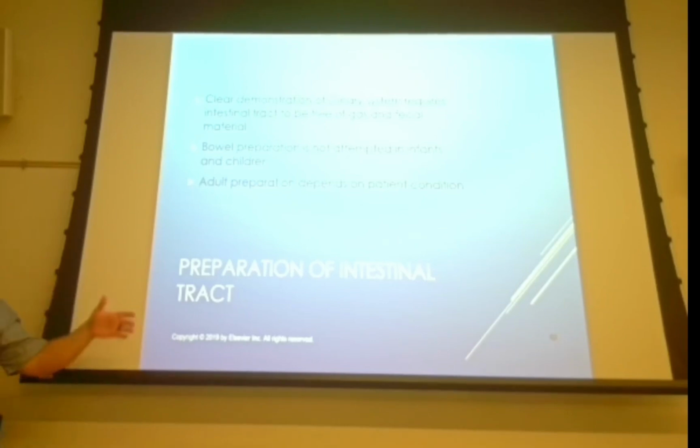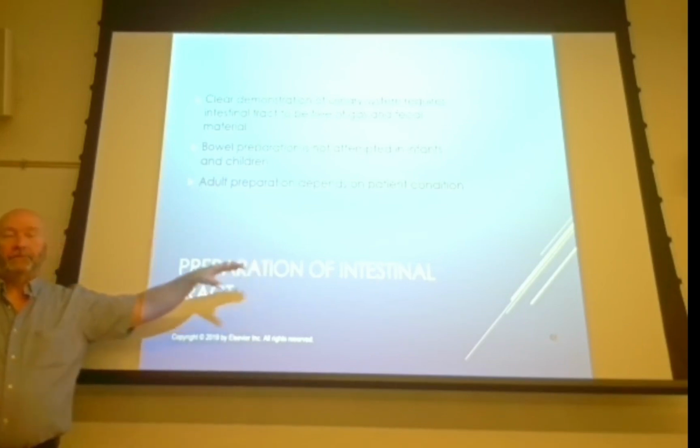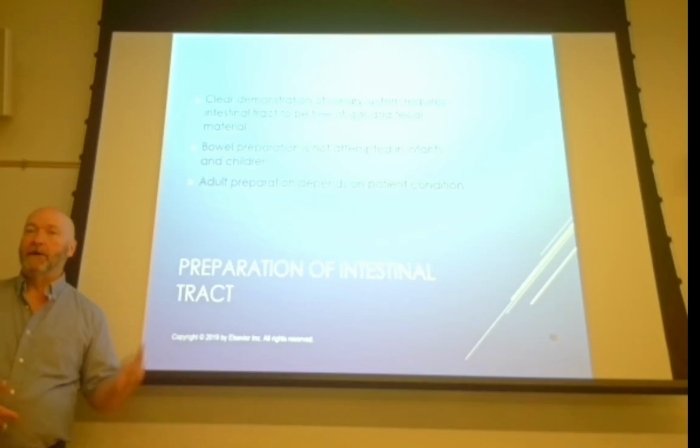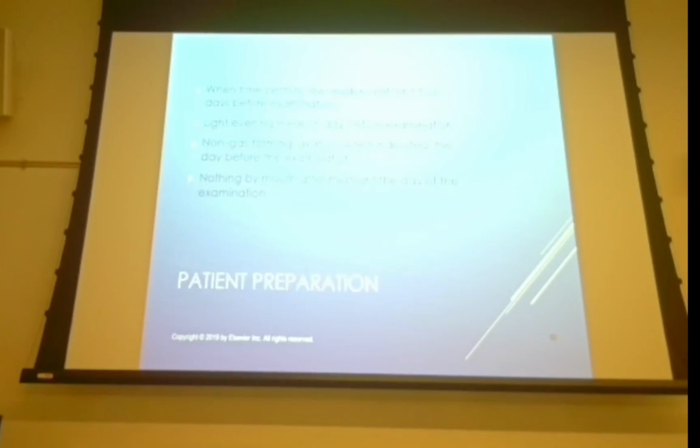Also, if we're doing a barium study, we have to start with this. Because it's iodinated contrast, it's not as dense as barium. If we put barium in the patient and follow it with iodine, you're not gonna get a study at all. If you start with iodine, the iodine's gonna be gone before you start with barium, okay? So you gotta start with the iodinated exams before you get into the barium exams. Okay, so just more patient preparation. You know, hydration.